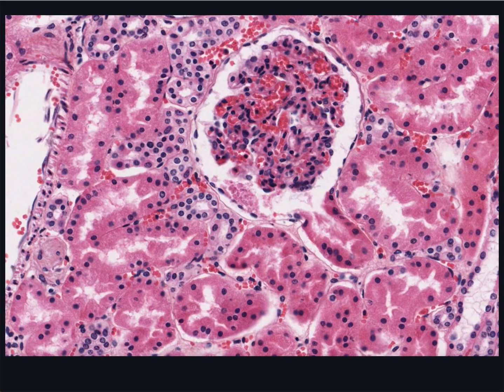The efferent arterioles run for only a short distance before breaking up into a second bed of peritubular capillaries, which nourish the proximal and distal tubules and pick up fluid. Even when these capillaries are collapsed, you can see abundant red blood cells inside their lumen.